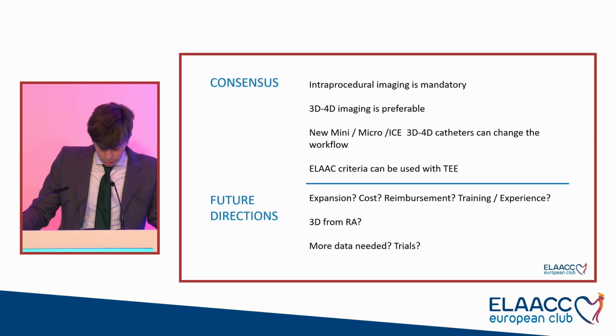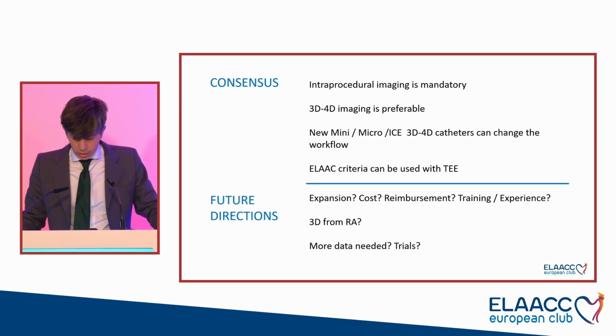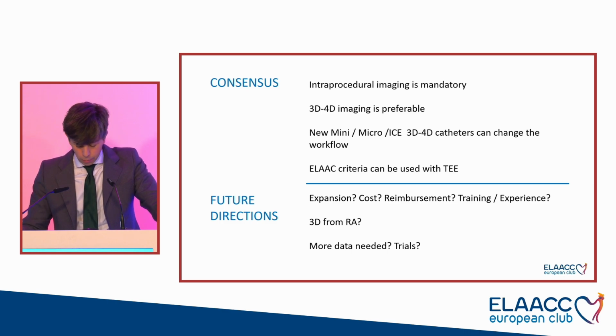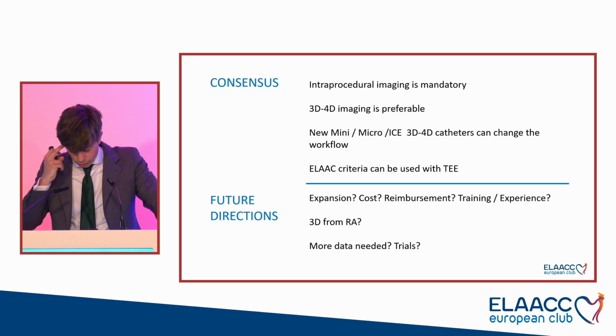So what are the future directions? I think, and we have also discussed this, there's a problem for the expansion of this technology, and that is its cost. It's clear that cost is a problem, and of course reimbursement is a problem. Here most of us, or all of us, are really experienced operators and echocardiographers, but I'm sure that we need training. There are a lot of centers that need training and experience, so I think the companies also have a big role in this, because if you don't have enough training and experience, you can have problems with this.